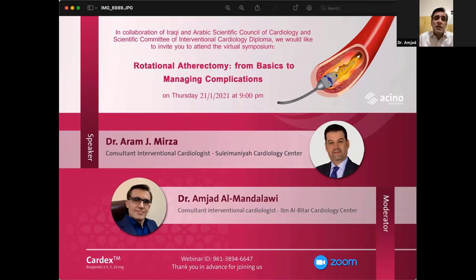I asked you about rotational atherectomy for bifurcational lesions. Do you have any notes about that? Yeah, this is a very good question. When we are doing ordinary conventional PCI for a bifurcation, definitely you have two wires, in the main vessel and the side branch. But when you are doing rotational atherectomy, we should have only one wire. There is no place to put another PCI wire in the side branch.